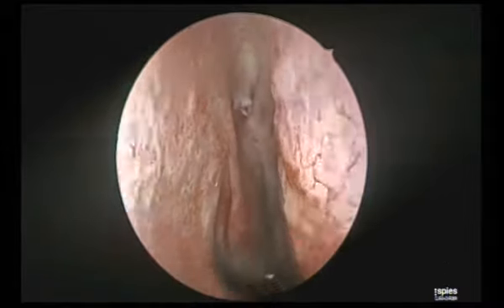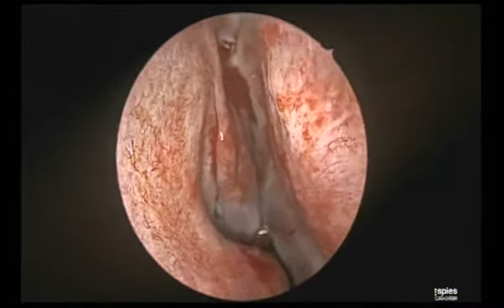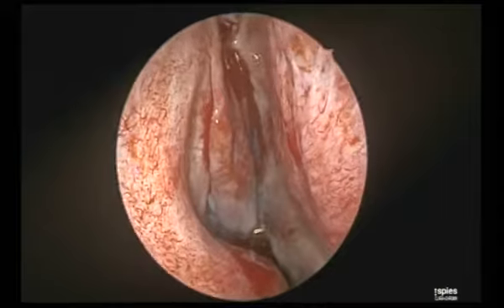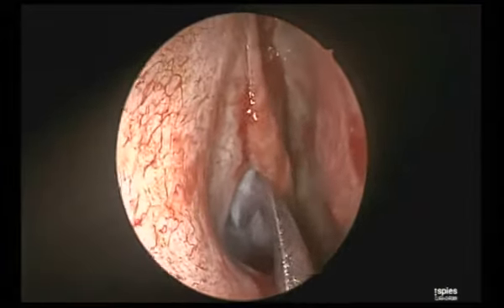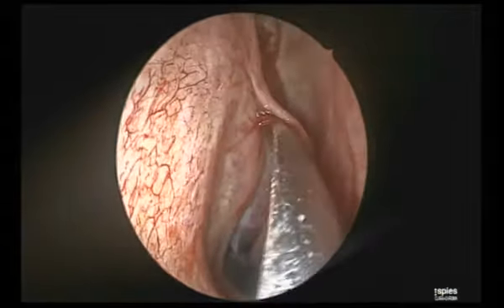So it is a polyp. Okay. I think the surgery is over. Thank you. Now see what it has given. It has pushed the middle turbinate medially, and see how it has thinned out. It has totally demineralized it and made it floppy.